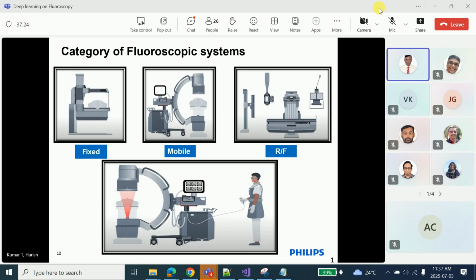So it is very important that we finish these studies within the purview of time. I'm doing contrast so that I cannot keep repeating the contrast every time. There is a minimal dose according to weight per kg, 2 ml you give. So if I weigh 60, I give 120. If I'm 50, I give 100. Something around that range. We just cannot repeat these procedures. It should be first time right.